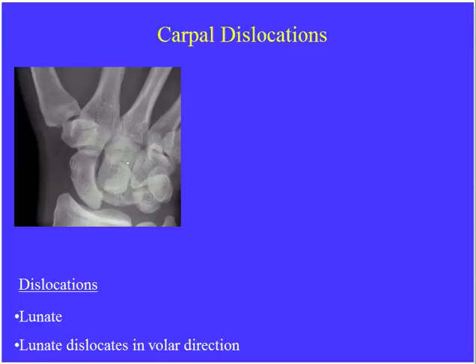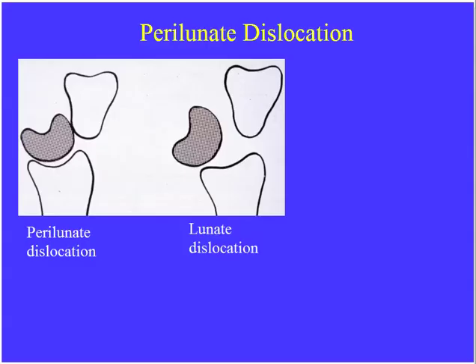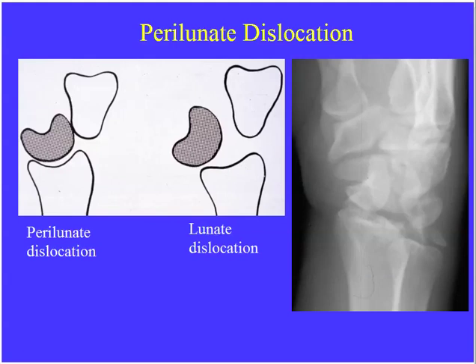They may show a carpal dislocation. On the frontal view, the lunate is typically quadrilateral. When you see a triangular appearance, that represents a lunate dislocation. They may ask you to differentiate between lunate and perilunate dislocation. With lunate dislocation, there's complete dislocation of the lunate anteriorly, while the capitate maintains its normal position. With perilunate dislocation, the lunate maintains its normal position articulating with the distal radius, but the capitate has dislocated posteriorly.